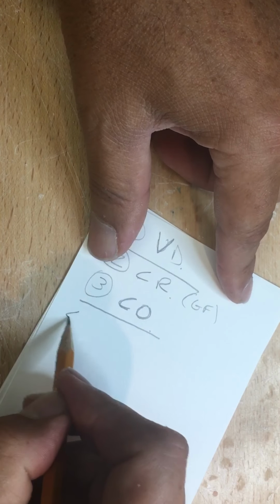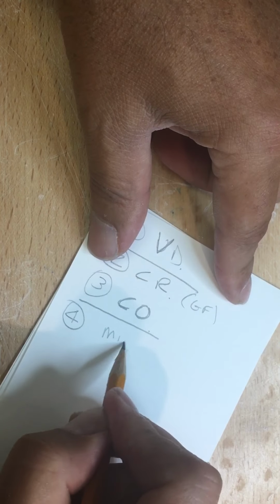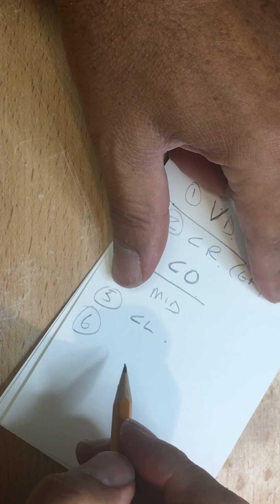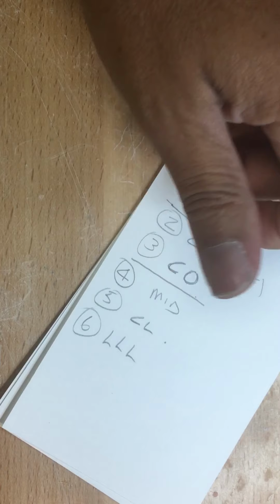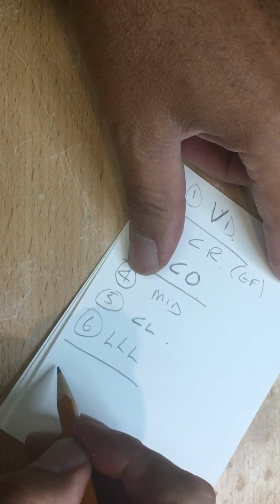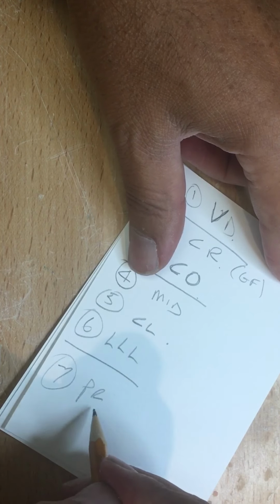If there's anterior space missing, obviously midline. Canine line. Number 6, low lip line or smile line. This would be in the anterior section. And if it was a maxillary, then the last registration would be protrusive bite record.